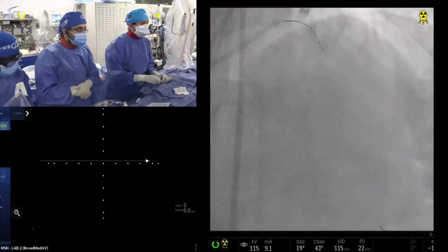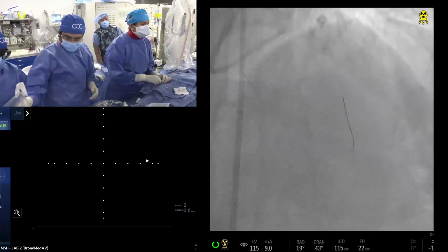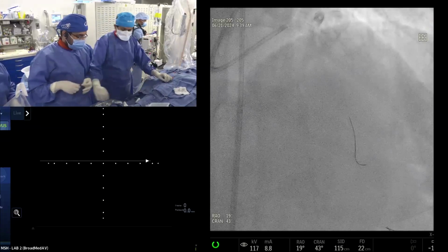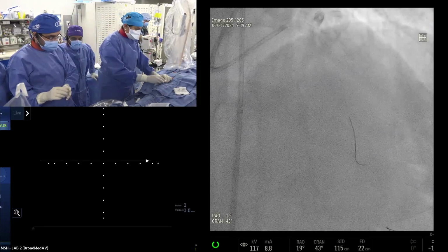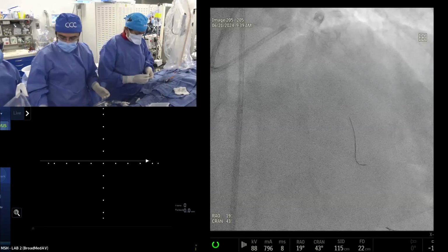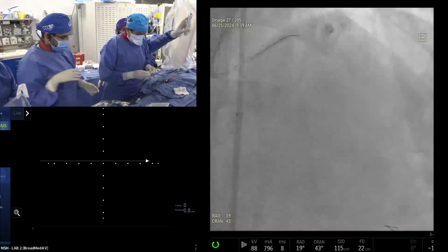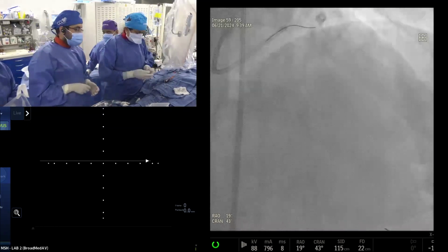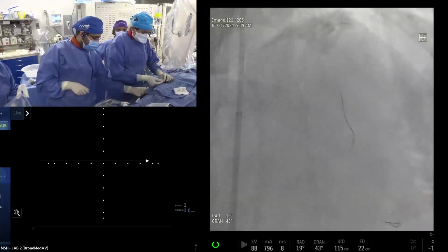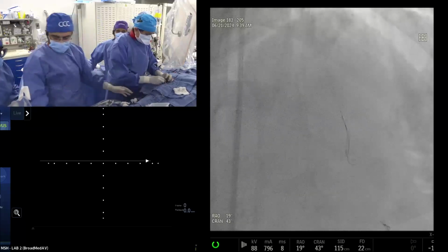Okay, now what happened is that I did a rota, I was on the rota wire, and it didn't go. And now we are putting a wire side by side. Good. There's somebody talking on the side. You have to mute. I could not go trying to do the IVUS on the rota wire. We did direct rota wiring. So now I did a run-through side by side. We'll try to go with the IVUS on the run-through wire now.